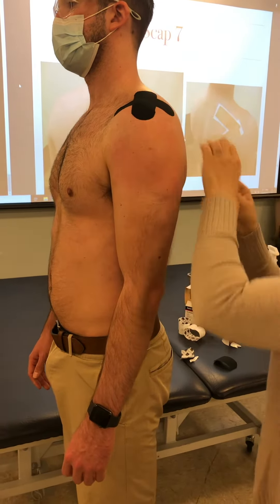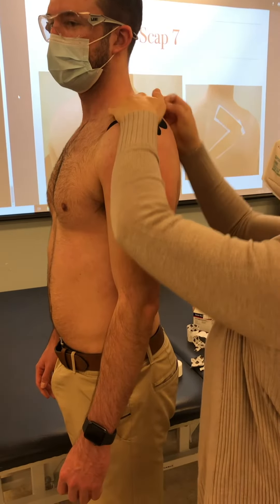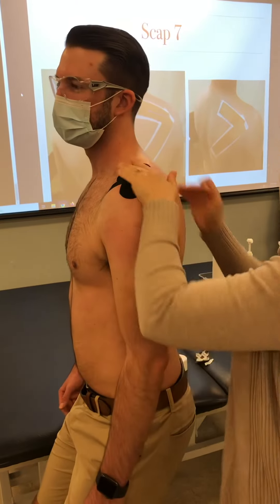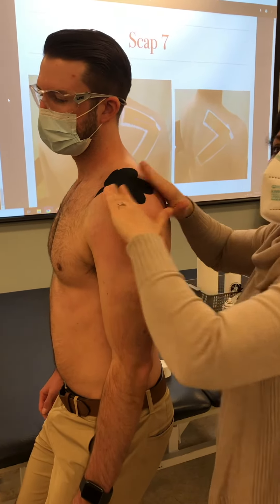And then you're going to push it in. And for his size, I could have even made these a smidge bigger. But you see how it's really staying localized to his AC area.